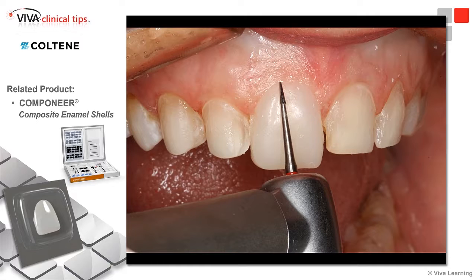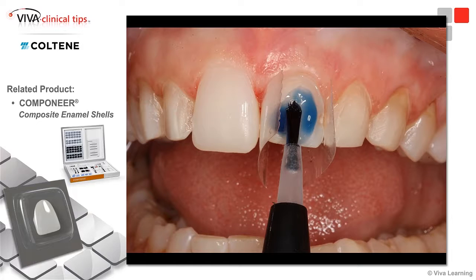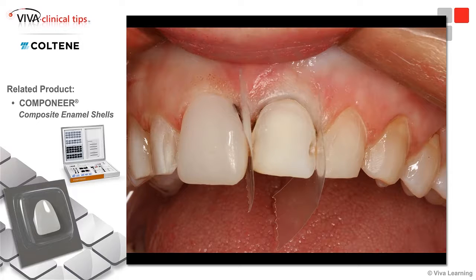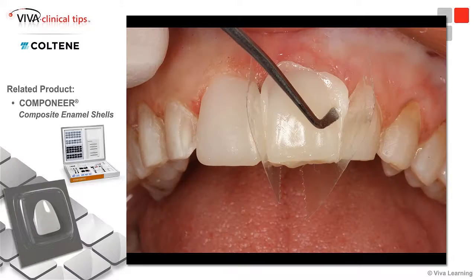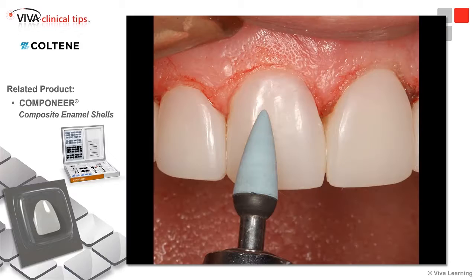And now I'm using my carbide finishing burs and all the other items that I use to normally contour direct composite veneers. I'm using the Swiss Flex aluminum oxide strips here on the proximals, and we just finish that the normal way that you would any direct composite. Here I'm adding my second direct composite veneer, and that's on the central with bonding agent. Added the COMPONEER, cleaning up the body shade, light curing, the same type of finishing all the way through.